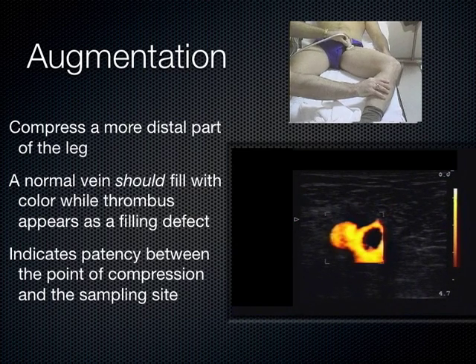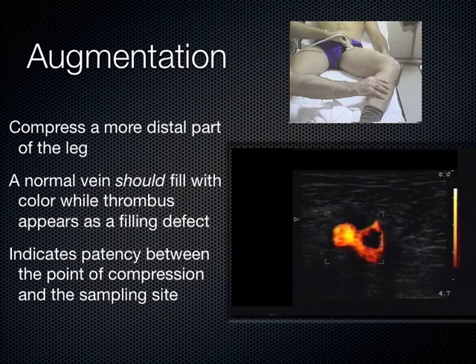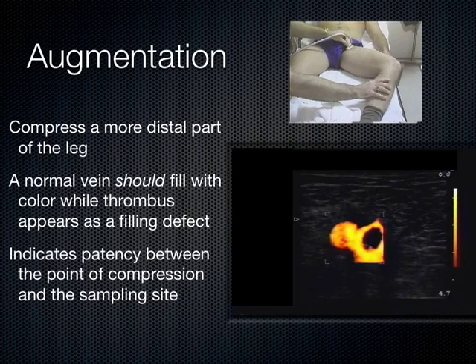It's really only the grayscale compression alone, the 2D ultrasound image, no color involved, that rules in or out the DVT. There are lots of other color techniques that don't stand up under clinical conditions, and so you can't really use that. Even though today we'll probably be doing it because it's fun to see the anatomy link up that way. I think that's cool to show you, but diagnostically it's not useful.